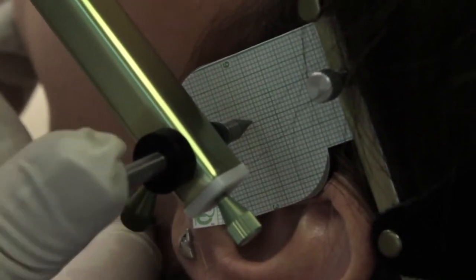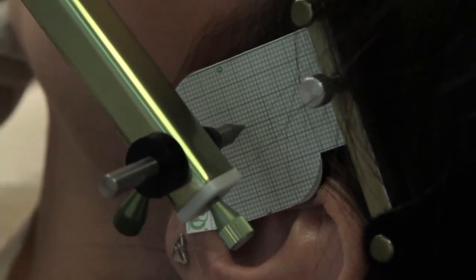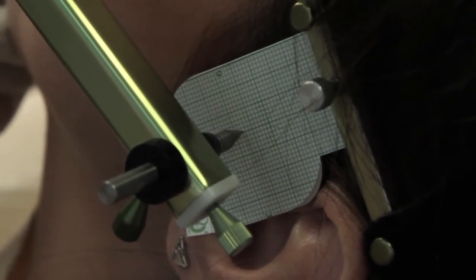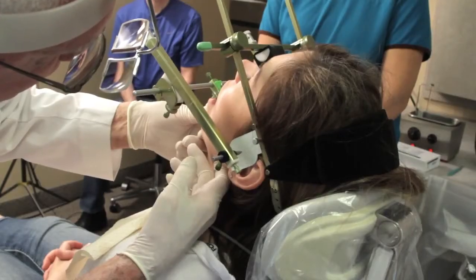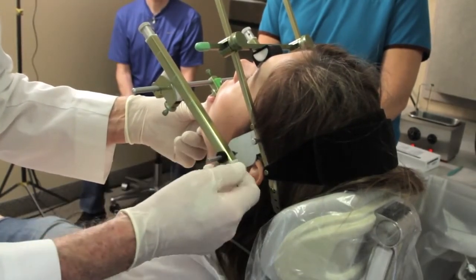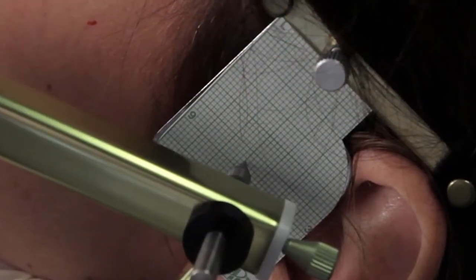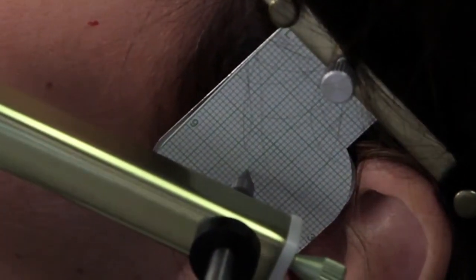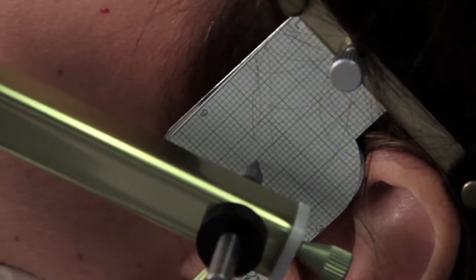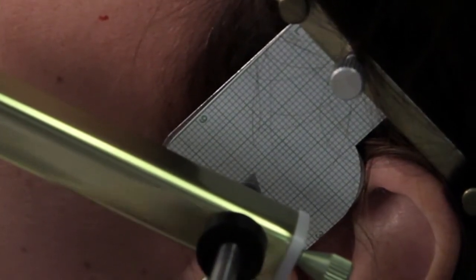So again, same procedure. Feel the chin, finger under gonial angle, touch the stylus pen against the flag. Open, please. Close. Good, stop. Now I'm going to pull the stylus pen off the flag so that it won't tear the flag, and I'll do the right side. I want to complete locating the axis. Okay, I've located the axis, lock the vertical, double check, open. Fine.